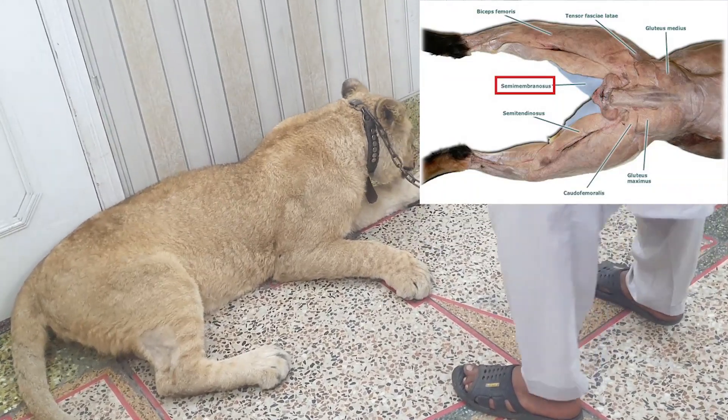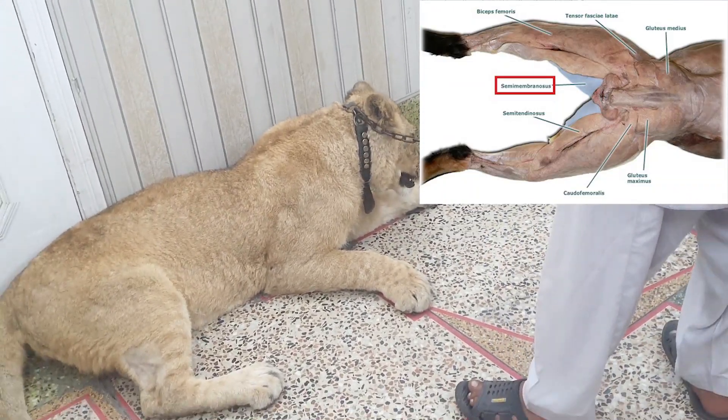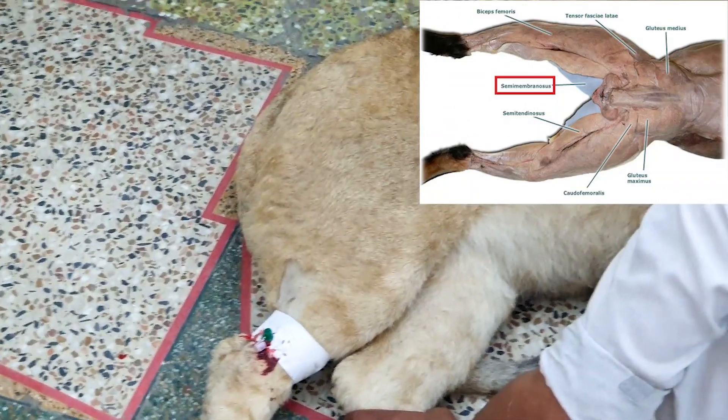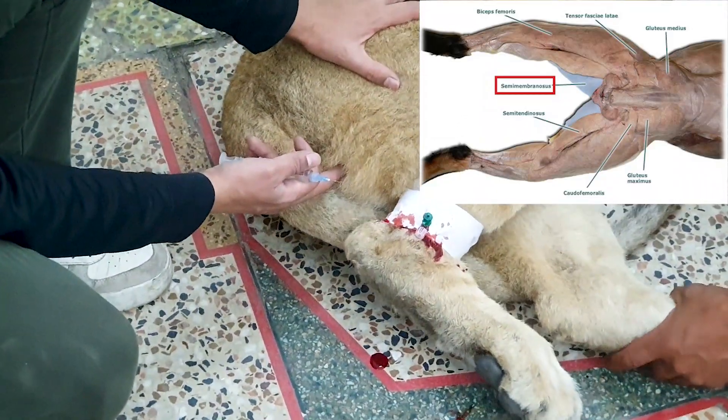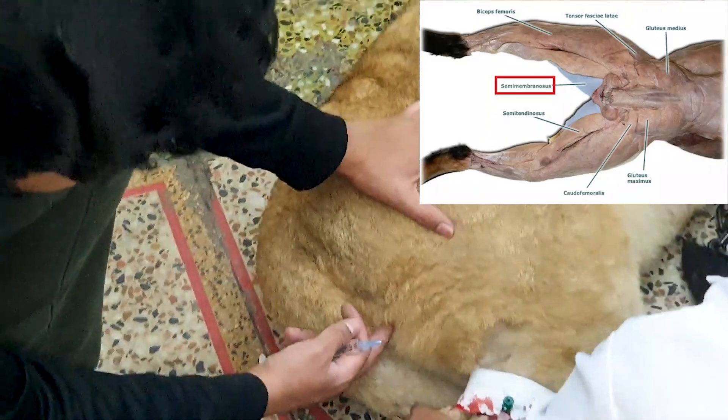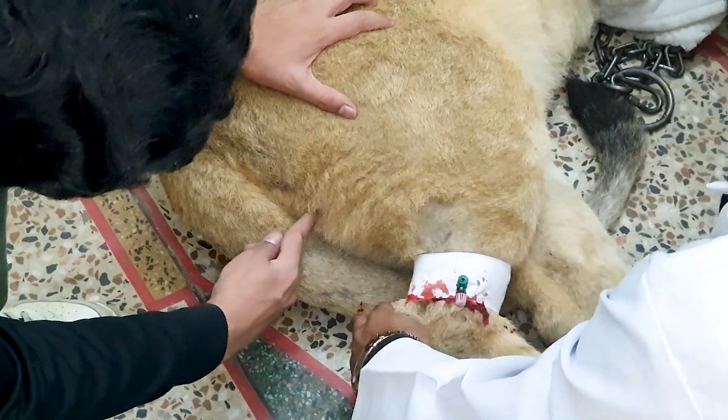As you can see in the upper right corner of the video, there are two muscles — semimembranosus and semitendinosus — in the hind limb of cats. The best place to administer the injection is in between these two muscles.